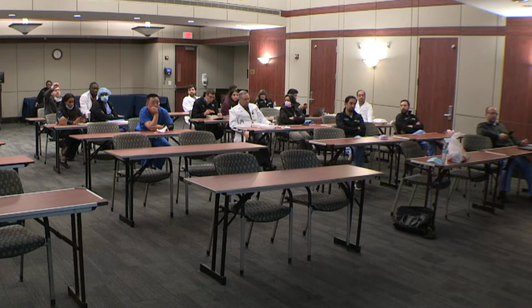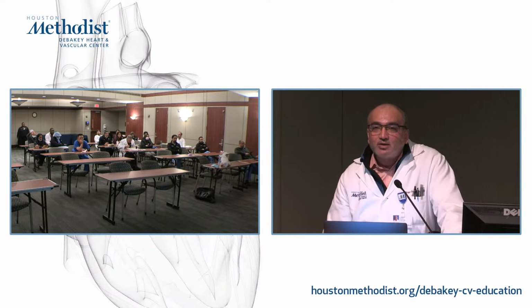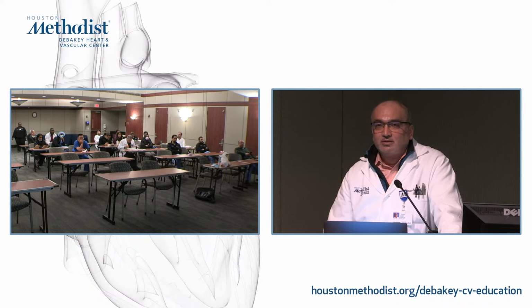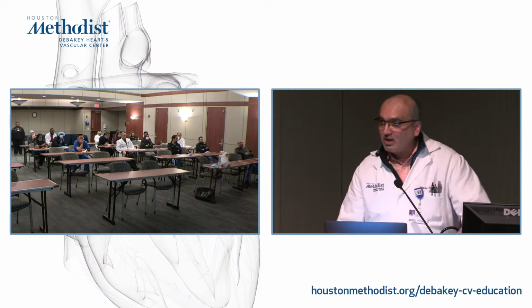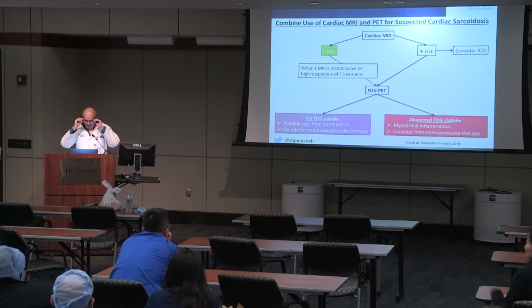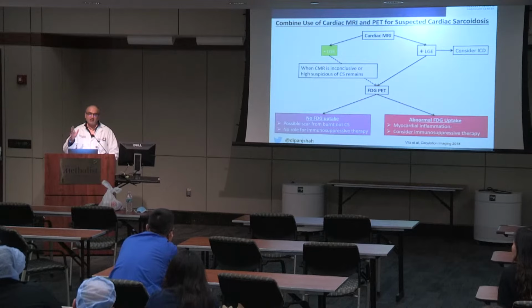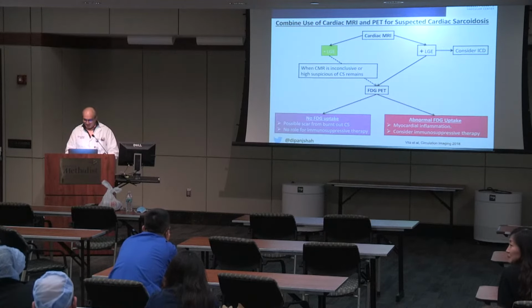Right. So how often do we see negative late gadolinium enhancement become positive? How often do we see more scar? Yeah, that's a great question. This is an area that's still emerging, but I think most people would say that if you have good quality LGE imaging and it's completely normal, then it's very unlikely that there could be any abnormality.